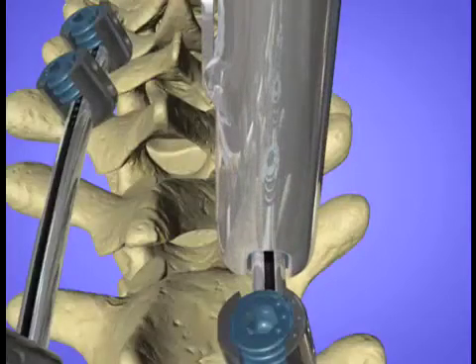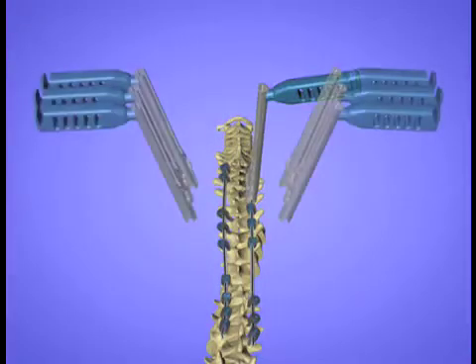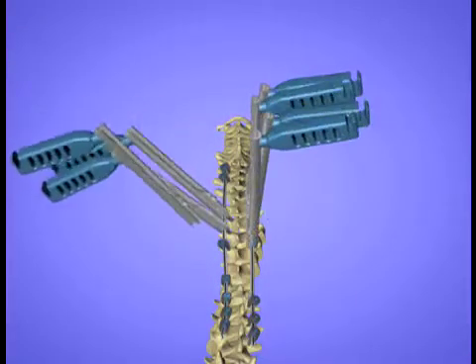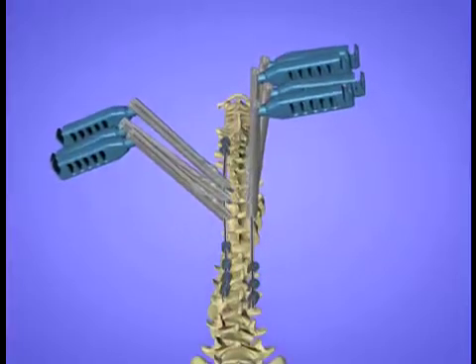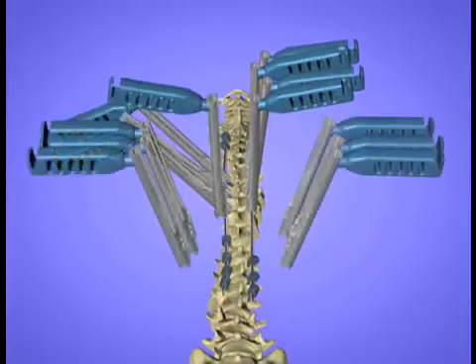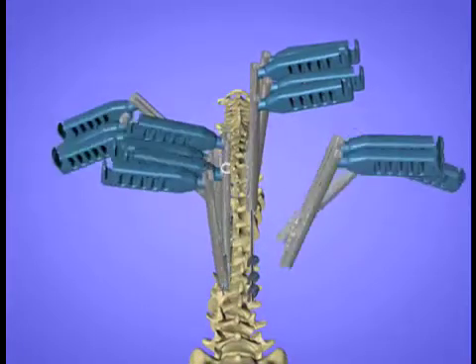Derotators are applied to the screws, starting with the right thoracic cluster. The plugs within the screws are not yet fully tightened, which facilitates the derotation.